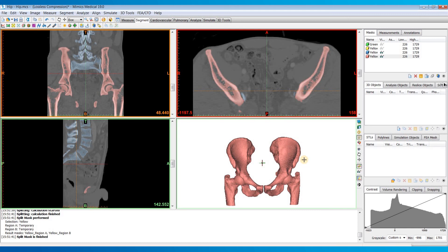I encourage you to give this tool a try — it's really useful for a lot of different things. I've used it for separating out an aorta or pulmonary artery from the rest of a heart, a mandible from a maxilla, and femurs from the pelvis. It's really become one of my go-to tools for a lot of different situations.